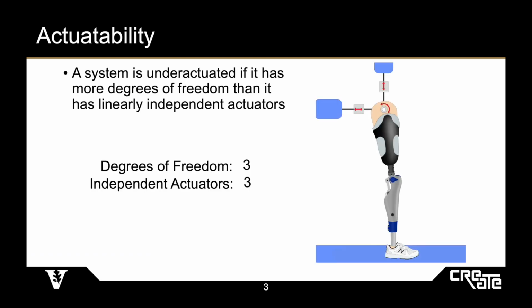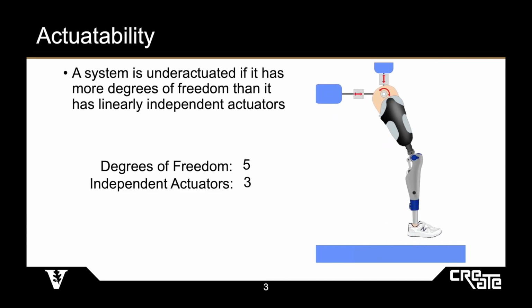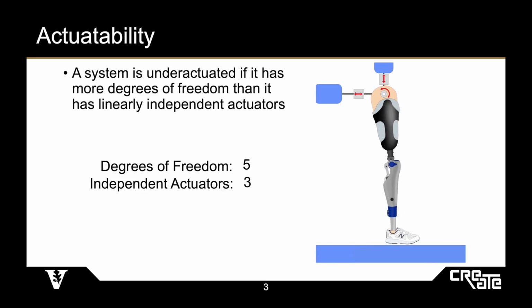A passive knee prosthesis can be modeled in two dimensions as shown here. When the ankle remains grounded, the system is fully actuated. Thus, it is mechanically possible for the user to dictate an arbitrary knee angle with their hip torque. However, if the foot comes ungrounded, the system becomes under-actuated. And while the user can still affect the knee angle through the double pendulum dynamics, they are no longer physically capable of dictating an arbitrary knee joint trajectory with an input torque at the hip.